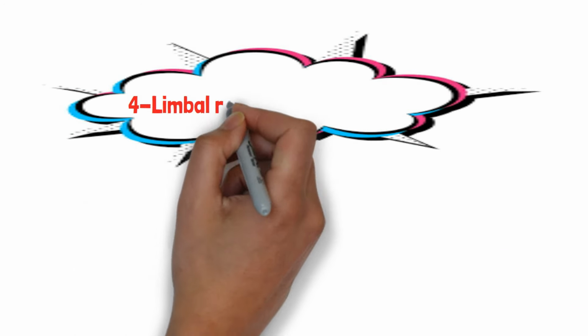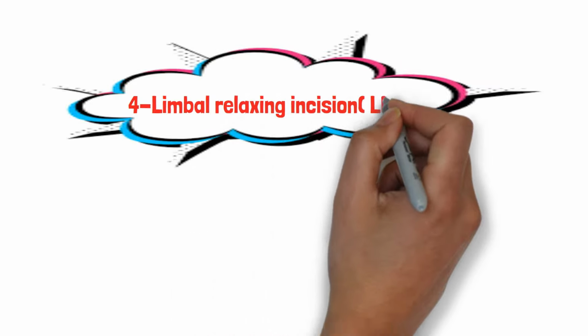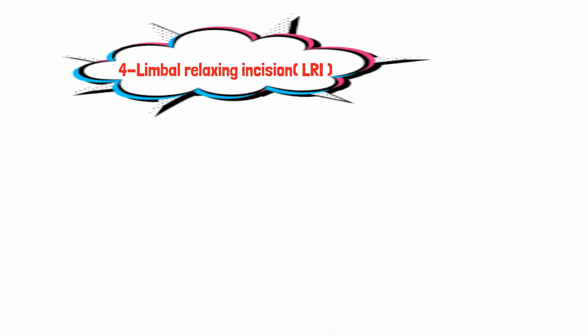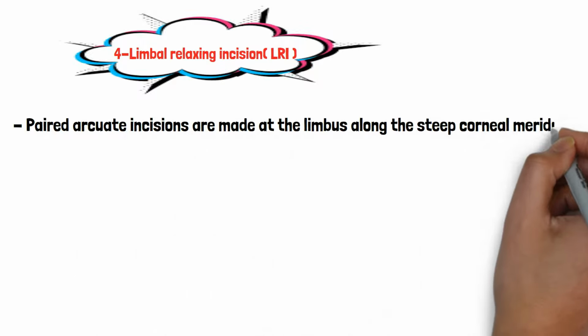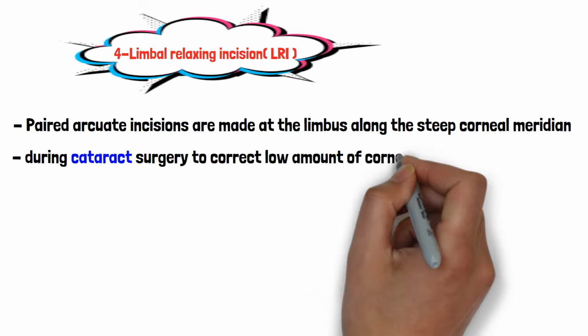Limbal relaxing incisions, or LRIs, became a common adjunct to cataract surgery. In this technique, paired arcuate incisions are made near the limbus along the steep meridian to correct mild to moderate corneal astigmatism without altering the central cornea.